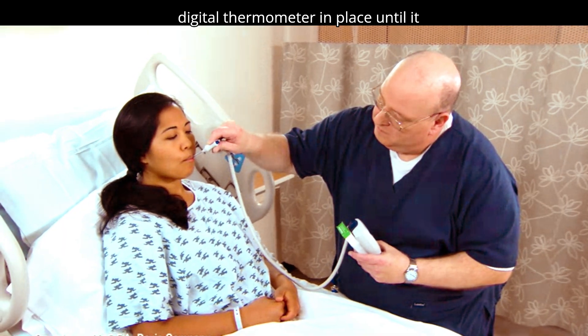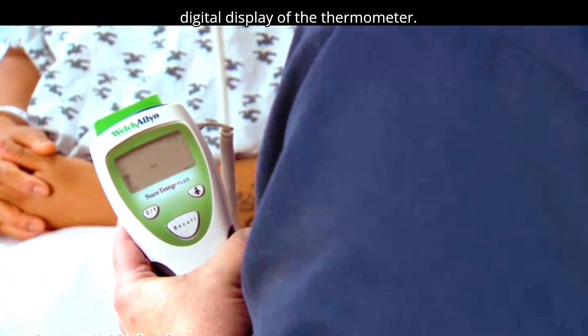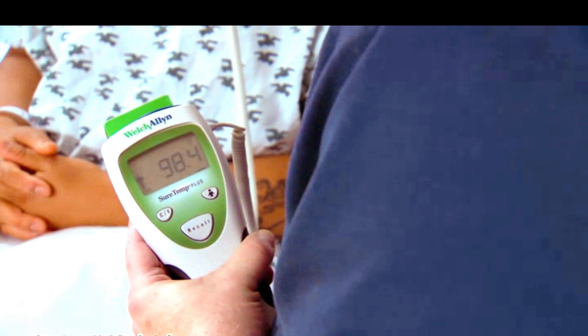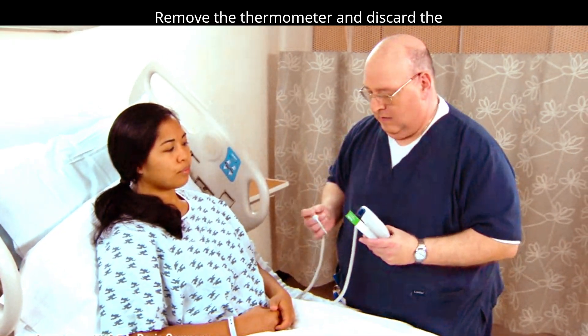Leave the digital thermometer in place until it beeps. Read the temperature on the digital display of the thermometer. Remove the thermometer and discard the cover.